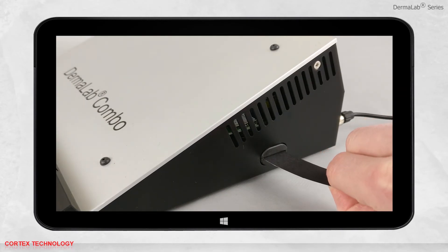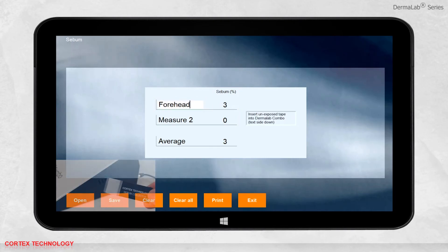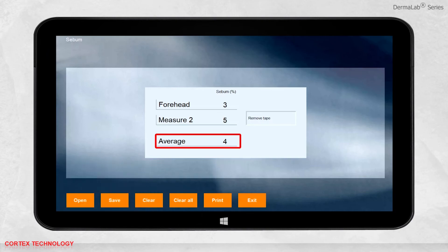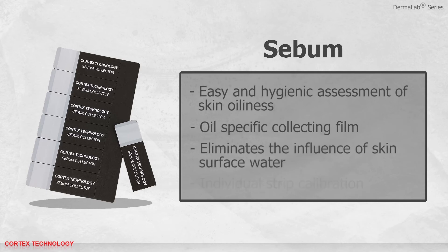Insert the tape back into the Dermalab Combo. The result will be presented in percentage, and you can change the name to anything you want. When taking multiple measurements, the average result will be calculated. You can save, print, or open previously saved data. The sebum module features easy and hygienic assessment of skin oiliness, an oil-specific collecting film which eliminates the influence of skin surface water, and individual strip calibration to improve reproducibility.